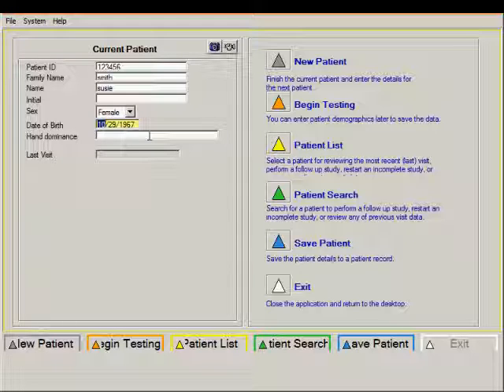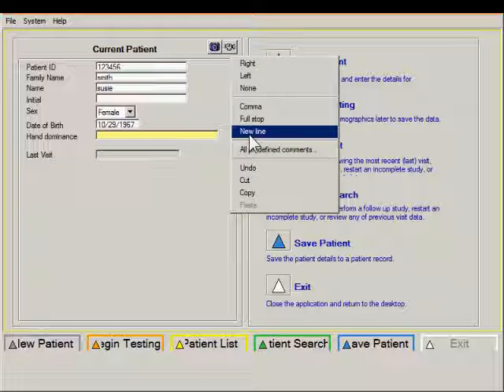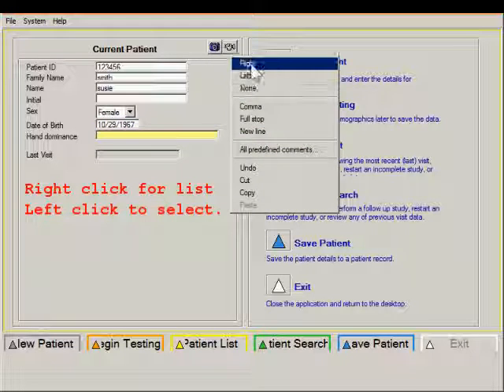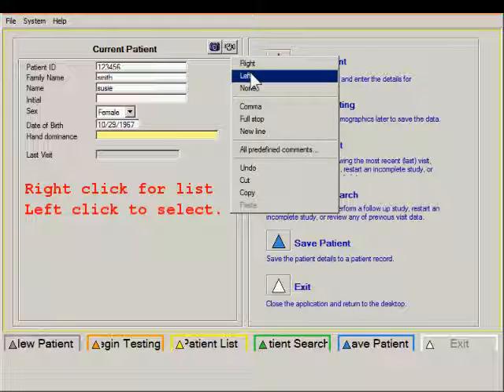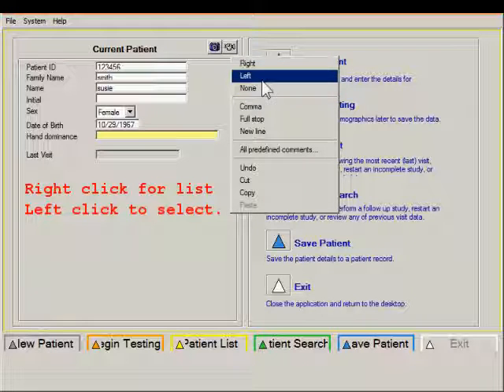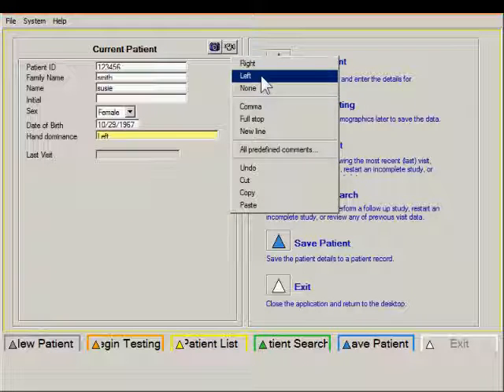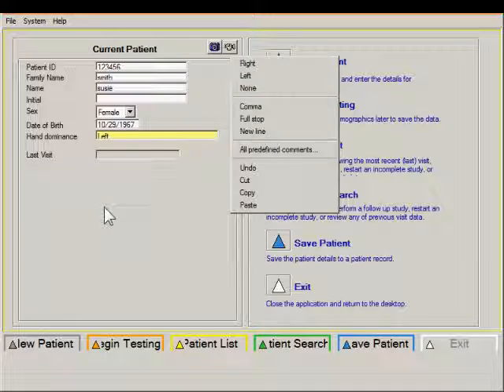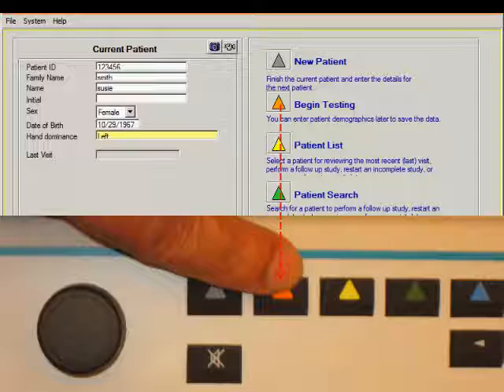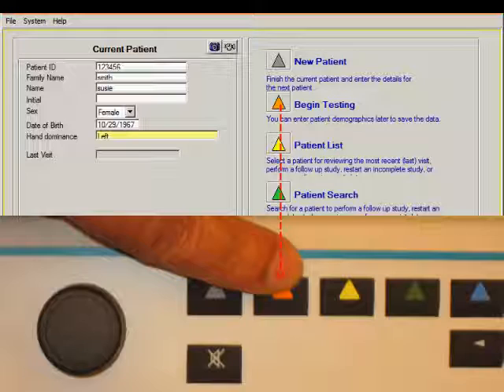The hand dominance can be selected from a right-click menu and you can select either right or left or no handedness if that's what's desired. Push the begin testing button to start this visit.